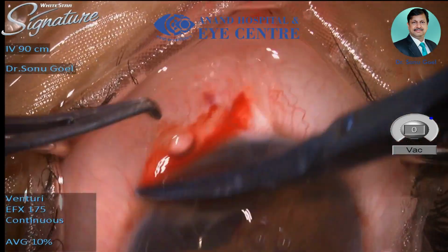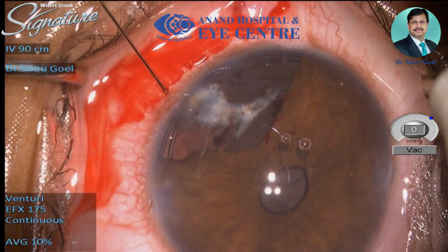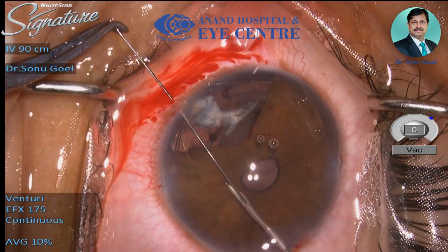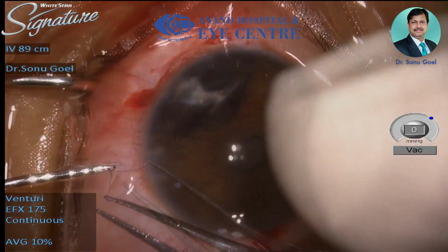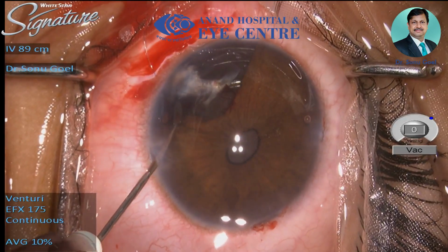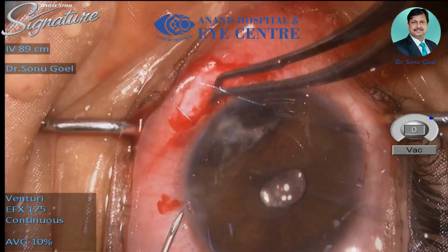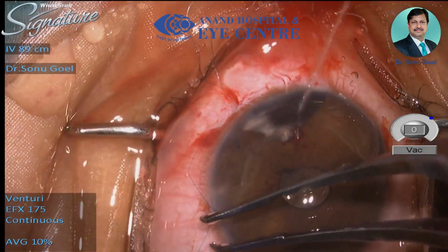So the peritomy comes first, a partial thickness groove is created. This is how the Prolene is tail-tracked into the 26 gauge needle, and this 26 gauge needle would now act as a source of the Prolene. If you see here carefully, it is threaded through the iris and externalized. The suture is then withdrawn very carefully and a loop is created.